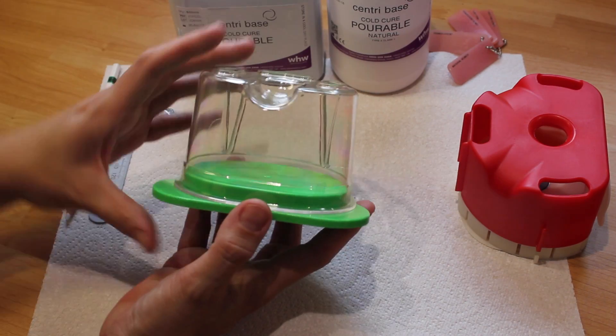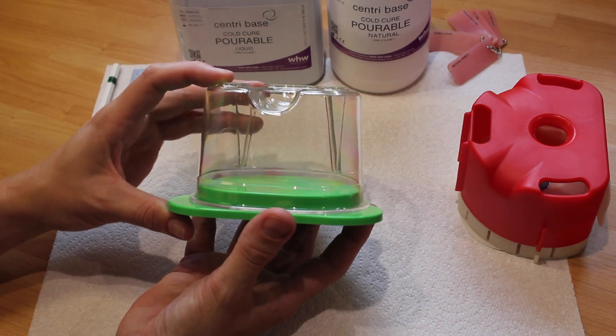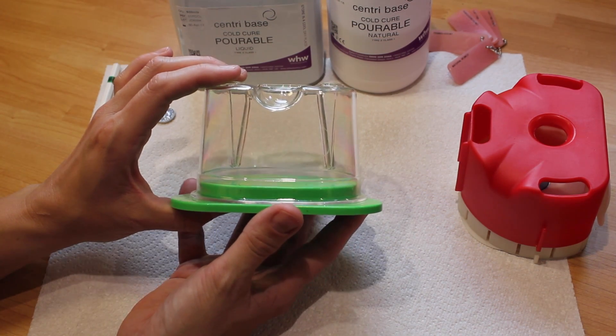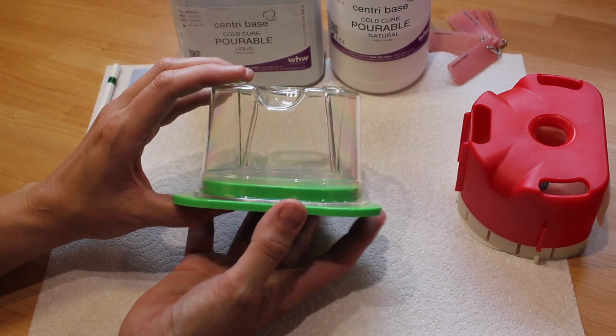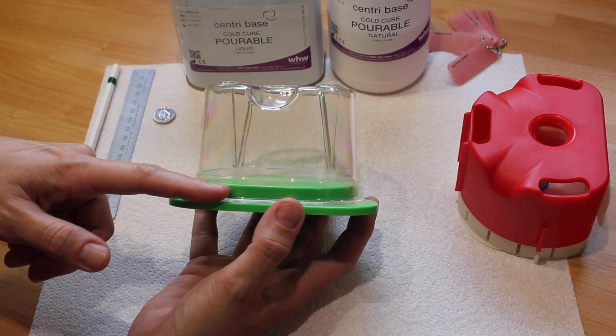So today we're going to customize a standard duplicating flask. What you'll need to consider as flasks vary in heights and shapes is where an average model will sit once it's raised by the base lip.